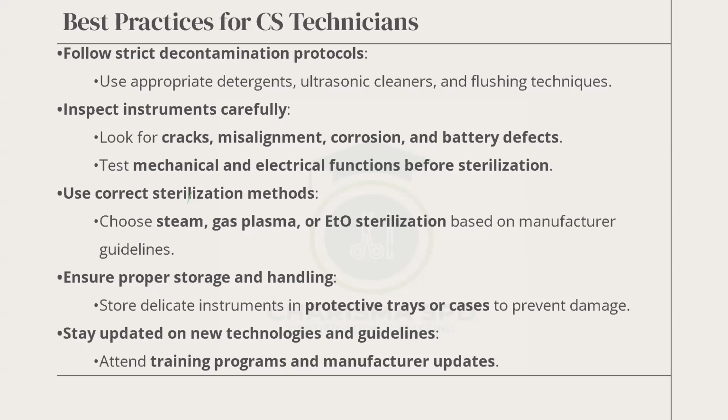Sometimes we have a soft mat in the basket, and they also have protected tips. We have silicone rubber tips that protect them so that even if they hit the walls of the basket, they won't get damaged. All because that is what the IFU is recommending. Then, to be able to do the right thing, we must attend training.